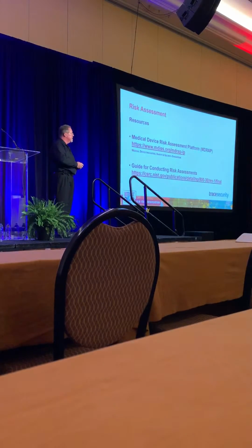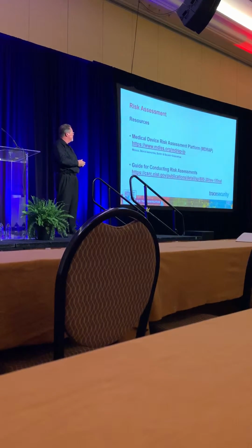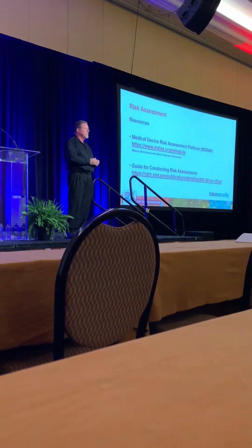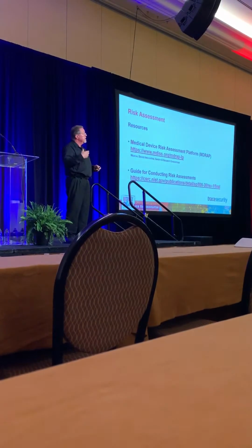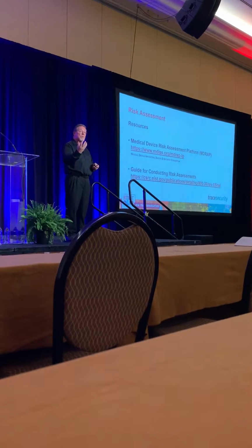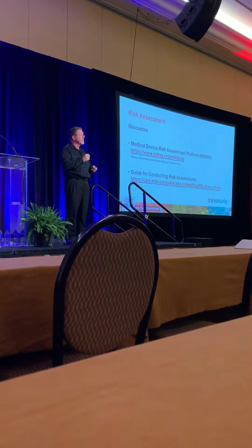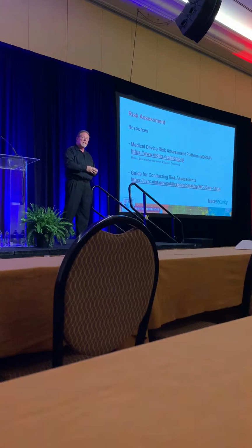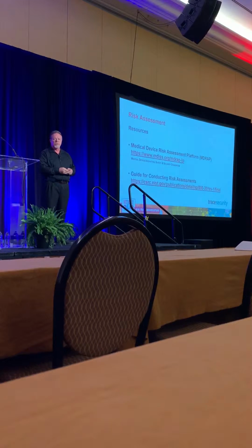There is another resource that I found very interesting, and I don't know if anyone else here has used it, but it's the Medical Device Risk Assessment Platform. Well, how this differs from a typical risk assessment platform is that it is a community effort, and the individual service delivery organizations actually upload inventories of their devices, and then they can share information about the vulnerabilities of those devices and risk mitigation strategies. So again, we don't have time to get into it, but I certainly encourage you to take a look at that if you're in a service delivery organization.